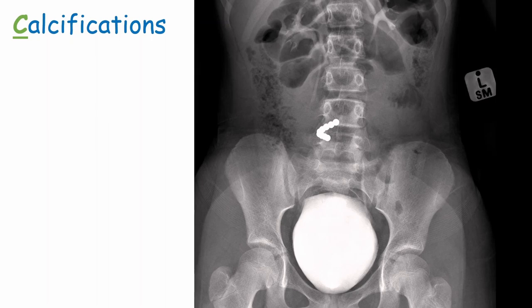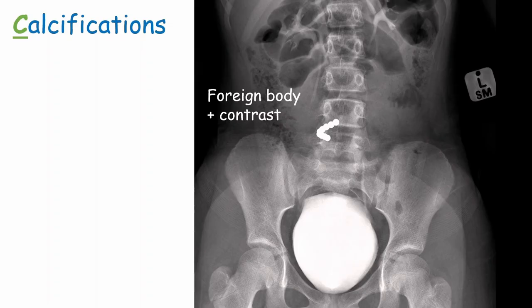In a young patient, nine magnetic balls that had been swallowed were visible in the small bowel, appearing to be in contact with each other in the same section. However, a CT scan confirmed that some magnets were actually in different loops of small bowel, pinching together pieces of bowel wall and causing ischaemia, necrosis, and perforation. A radiodense circle in the pelvis represented a bladder full of urine containing IV contrast given before the CT scan. The child required emergency laparotomy to remove the magnets and fix the perforations in the bowel wall.